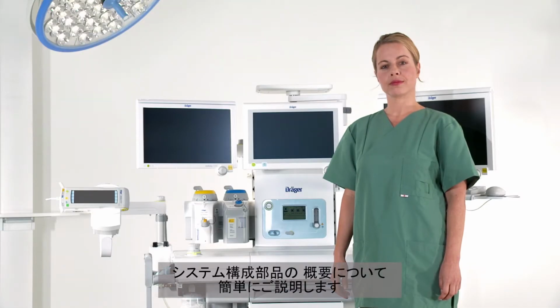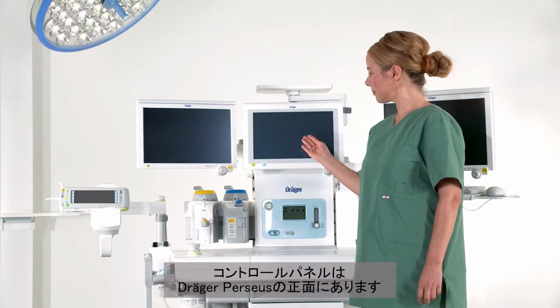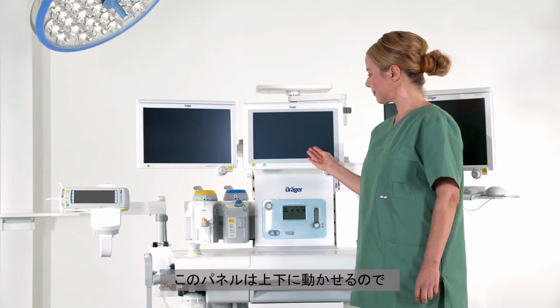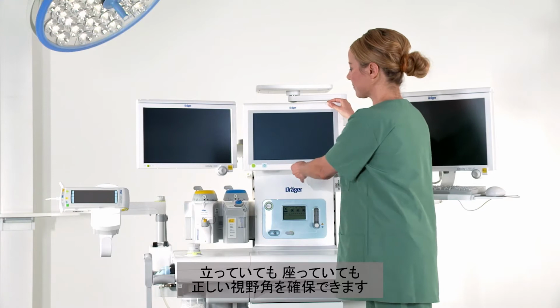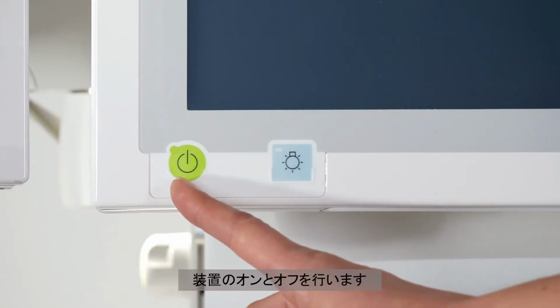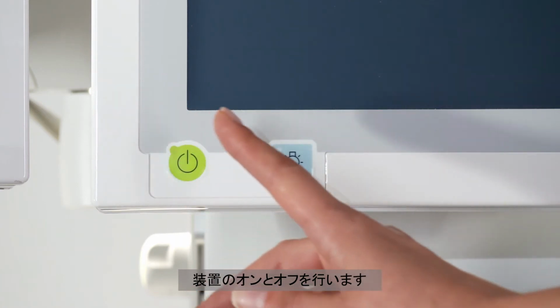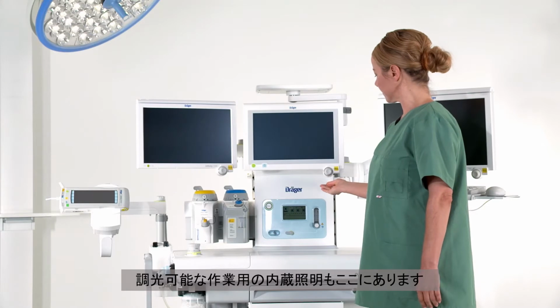The following provides a brief overview of the system components. The control panel is located at the front of the Dräger Perseus. You can swivel this panel upwards and downwards to ensure the correct viewing angle, whether you are standing or seated. You will find a button on the left side of the control panel which allows you to turn the device on and off. The integrated dimmable workplace illumination is also located here.